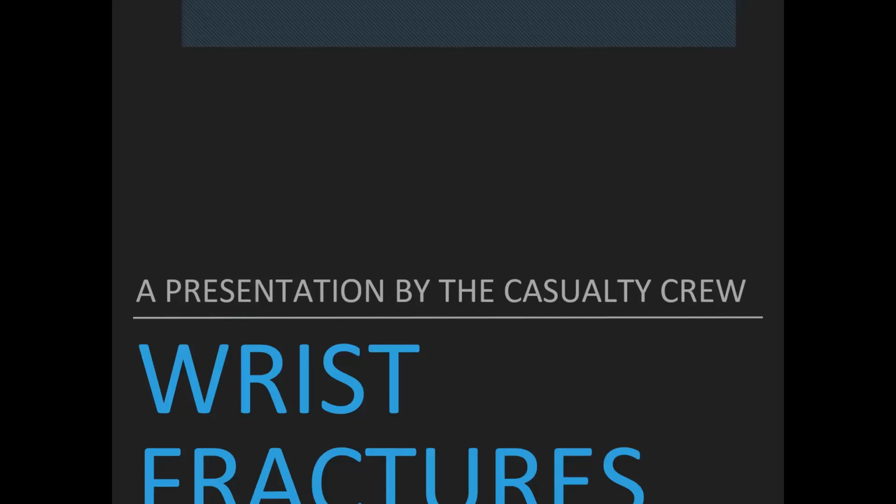Anyway, we had covered the upper arm previously, and we had gone through about three or four presentations, and then we finally get down to the wrist. This is a bit of an older presentation that I used to do with my students and interns and colleagues before, so it was done in an older format. So just the bit at the bottom is cropped out. I hope that won't be a major problem and that you can still see everything.